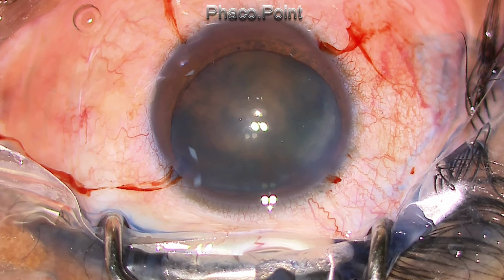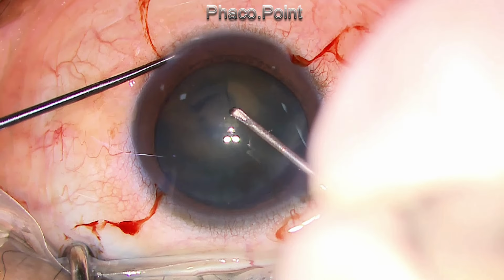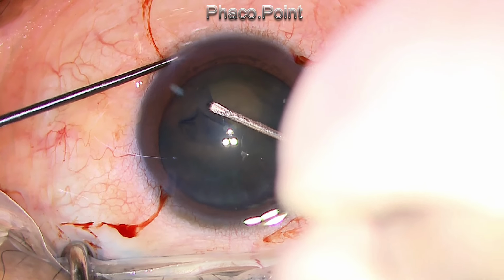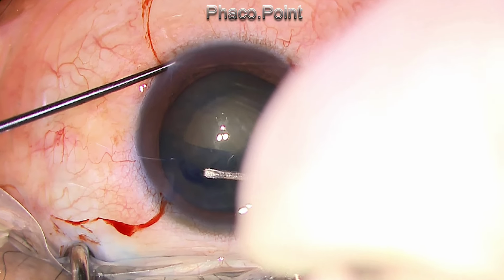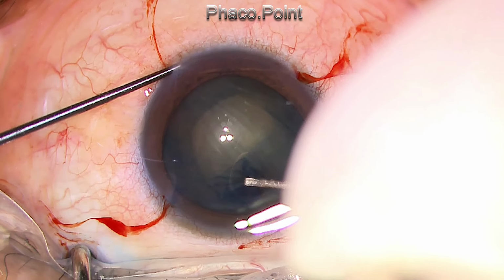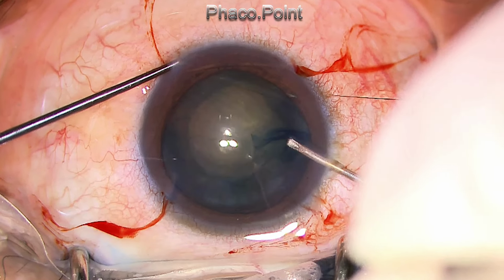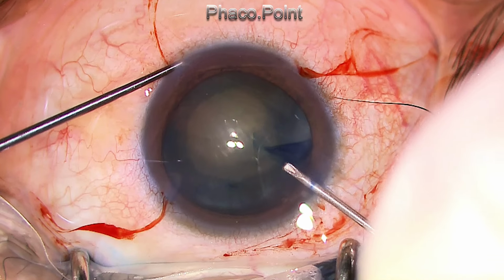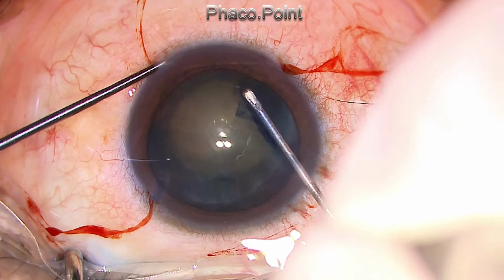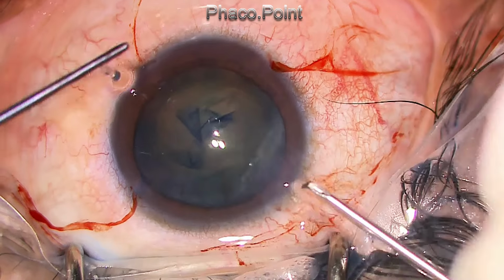I could see the equator of the lens. I started the capsular rhexis away from the dialyzed area. I used a cystotome and I gradually, carefully performed the capsular rhexis, giving a sufficient amount of posterior traction in order to be able to effect the tear, because it's not easy to create the tear when there's a zonular dialysis due to the laxity of the anterior capsule. You have to give enough traction force in order to pull this capsule and create the adequate tear. In this patient, I got a capsular rhexis size of about 5 mm, which was quite sufficient.